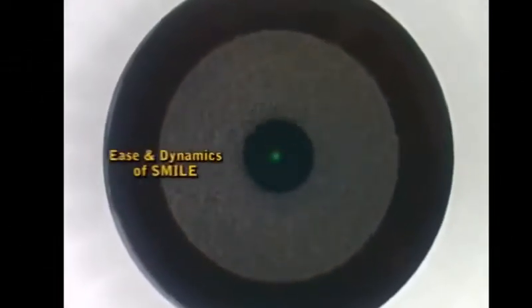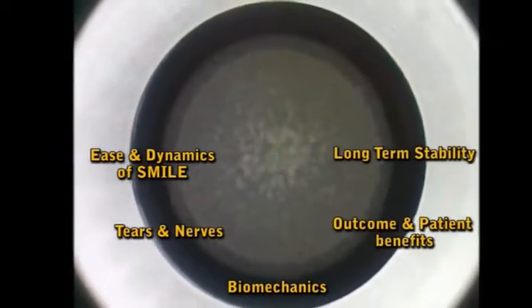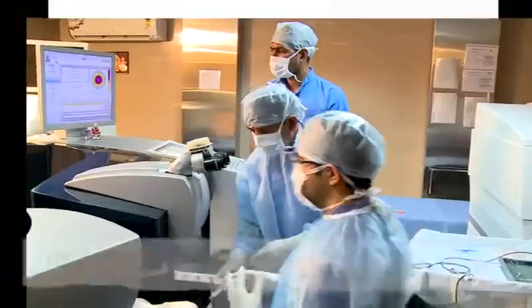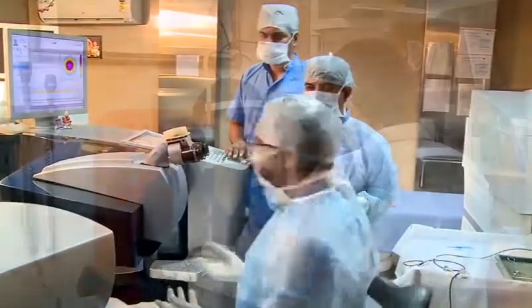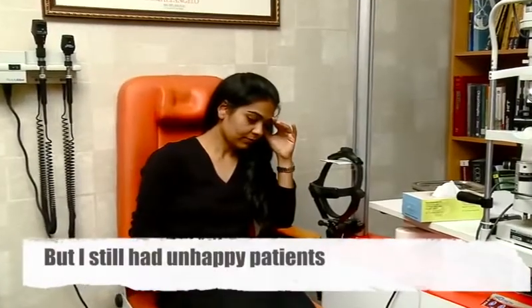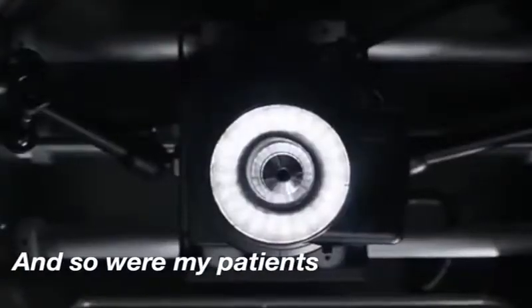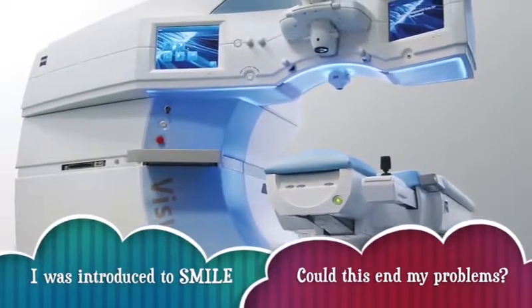Small incision lenticule extraction, or SMILE, challenges to change that and has the distinct advantage of being a flapless procedure. I never had a problem with creating flaps till the day I lost one. Even with extremely well performed femtosecond laser assisted LASIK surgeries, there were still unhappy patients and I did not know why. I started fearing flaps and so did my patients. Then one day, someone told me about the new flapless procedure called SMILE.